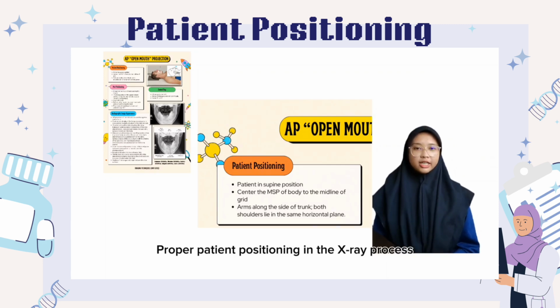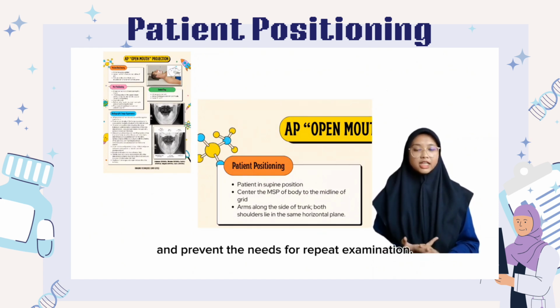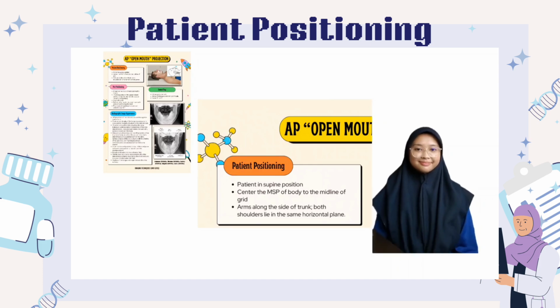Proper patient positioning in the X-ray process is crucial for obtaining a clear and accurate image, minimizing the radiation exposure, ensuring the patient comfort, and preventing the need for repeat examinations.